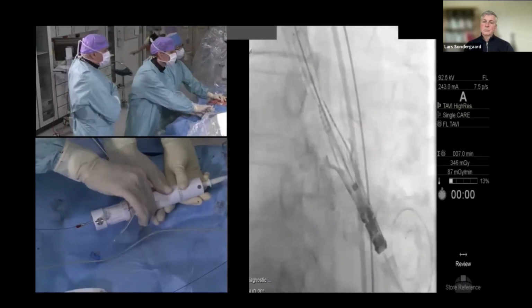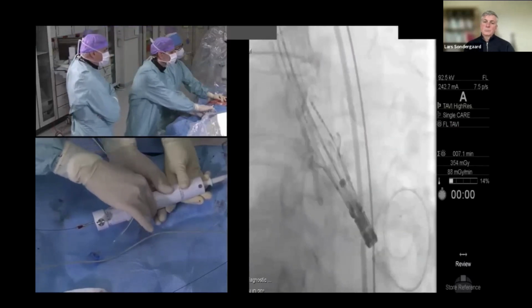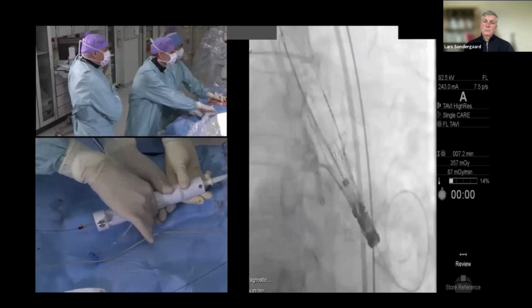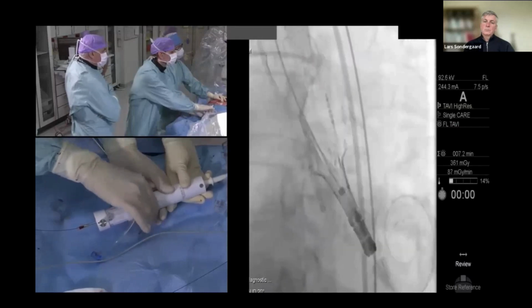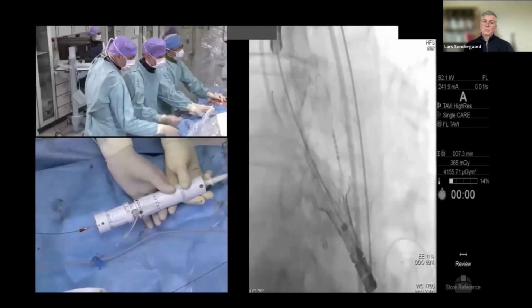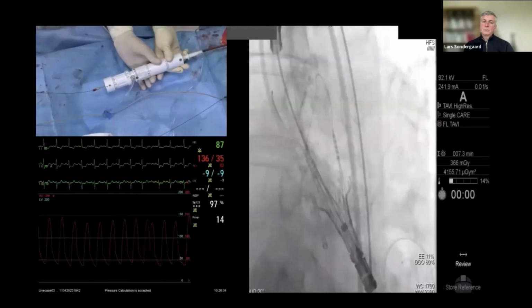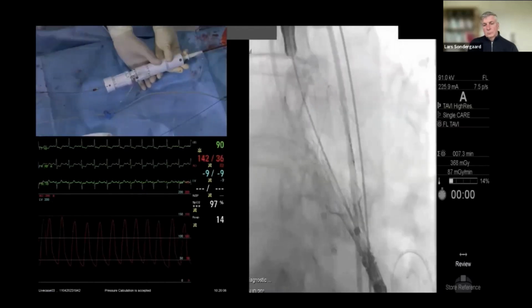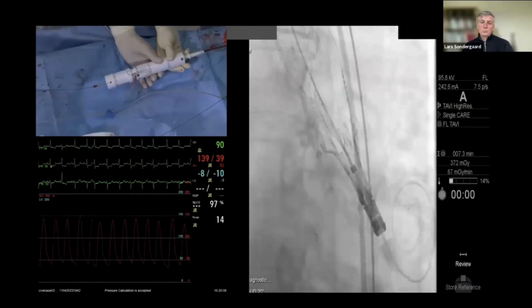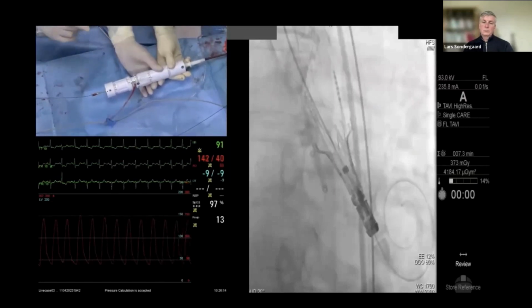Yeah, that opens nicely. The upper crown is coming out here, you see. And it's what we want, them to sit on the top of the calcified leaflets. And next you see the stabilizing arches are released like this. Yeah. So go to full stop here. And then we can remove that safety split here in order to rotate wheel number 2. Contrast. You want to check once again that we are where we should be with the contrast injection. So I could do contrast, and if we have, you can deploy in the same run.